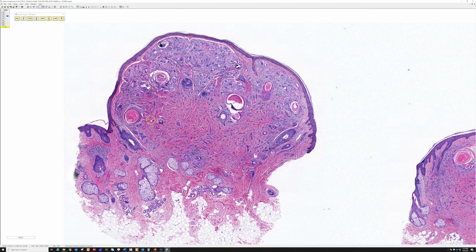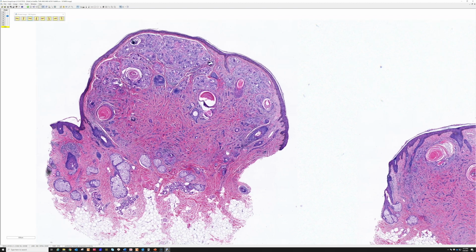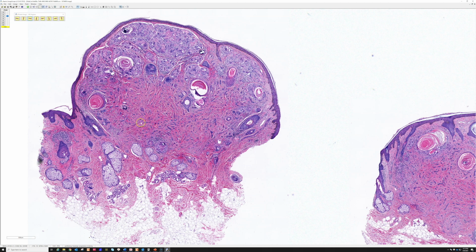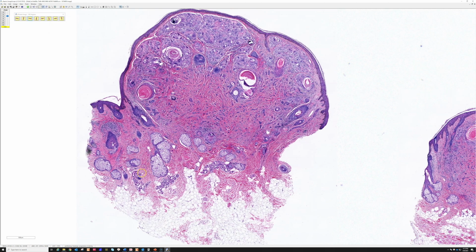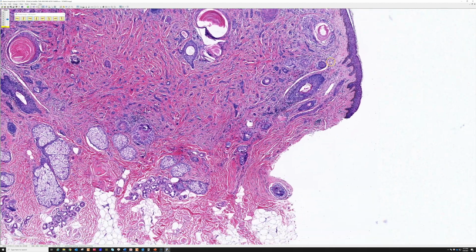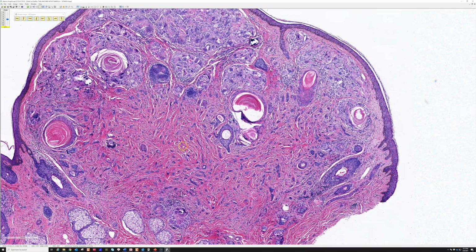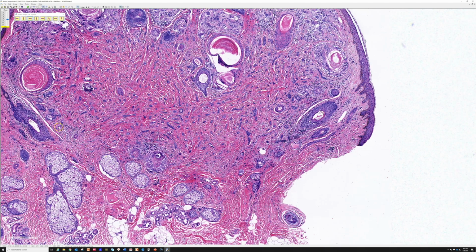And we can see that this lesion is slightly polypoid, a sessile polyp, and there is a proliferation of little blue nests and cords and strands of tumor cells here in this very densely sclerotic dermis. Look how dense the pink collagen is, compared to, say, the normal reticular dermal collagen down here, okay? And even though it looks very busy and infiltrative in the middle, at the periphery it's actually quite circumscribed. You can really see that there's a border to the lesion here.